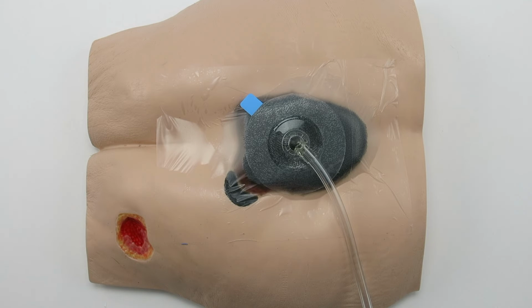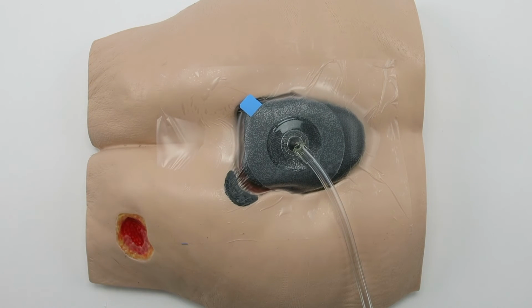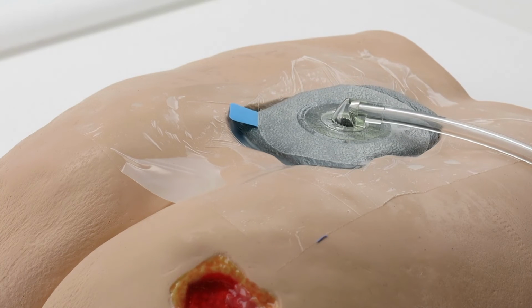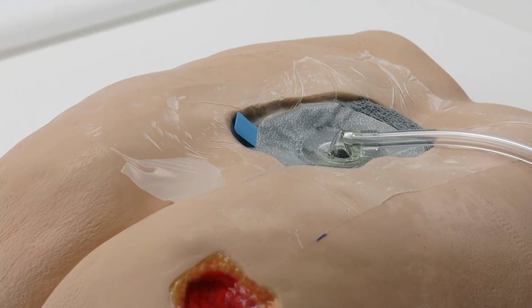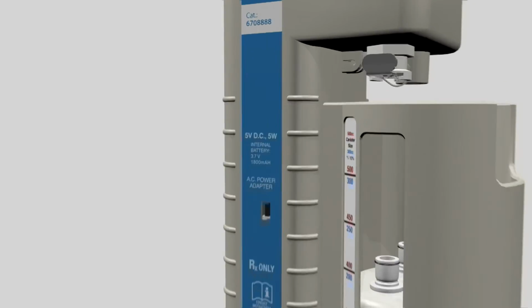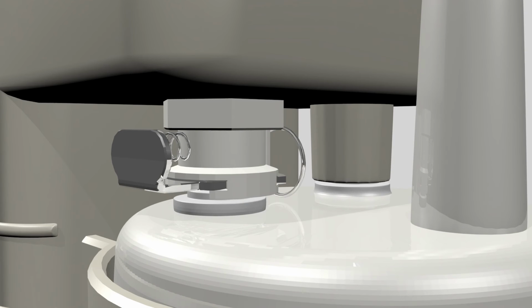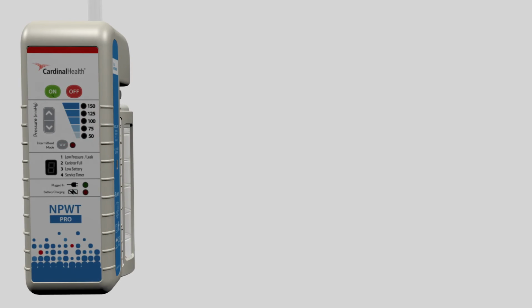If the leak persists, examine the drape for wrinkles that could be causing the leak. Press down around the edges of the drape until the foam pulls down. You can use additional strips of drape to seal any leak that is found. If the leak persists, close the tubing clamp temporarily. If the device still indicates a leak, then change the canister. If the leak continues, consult the user's manual or call the clinical support line.